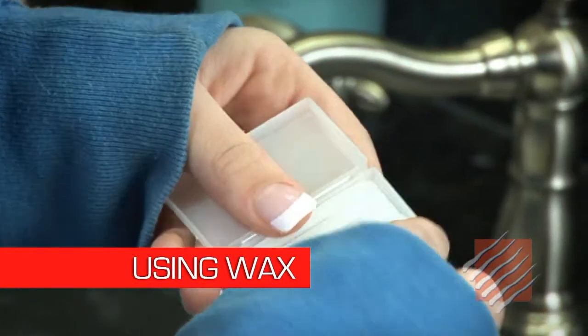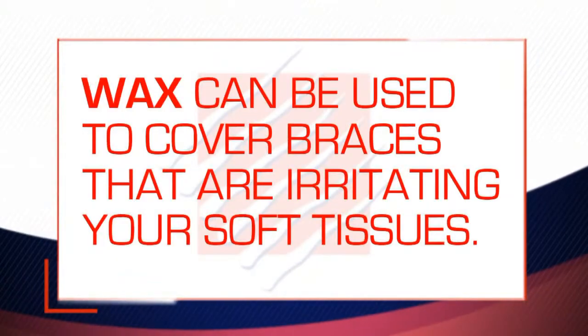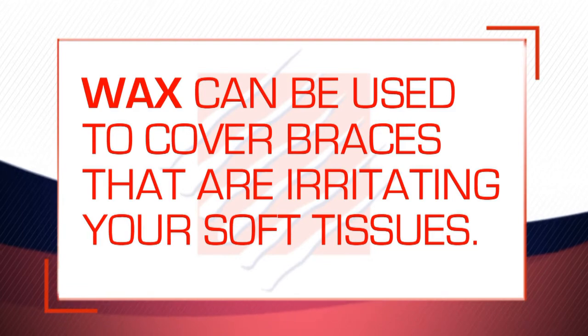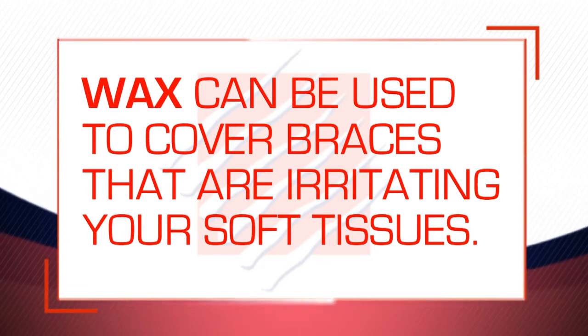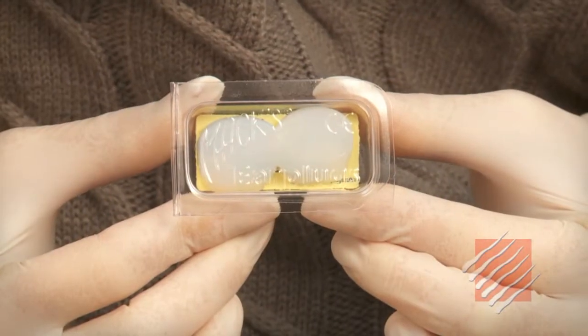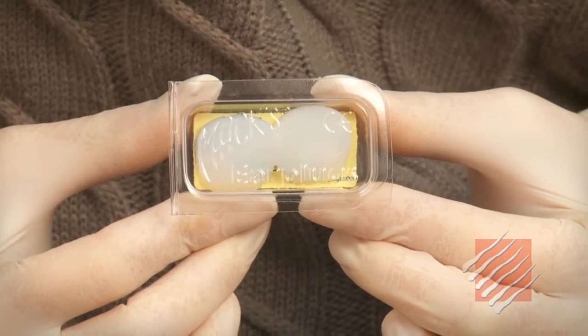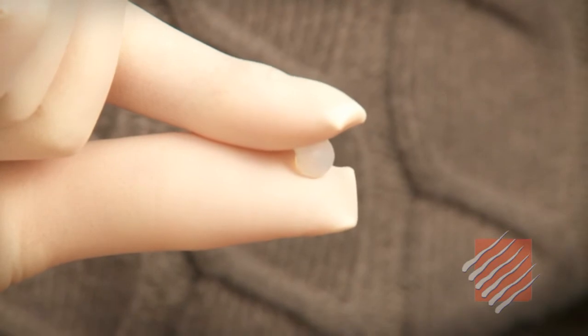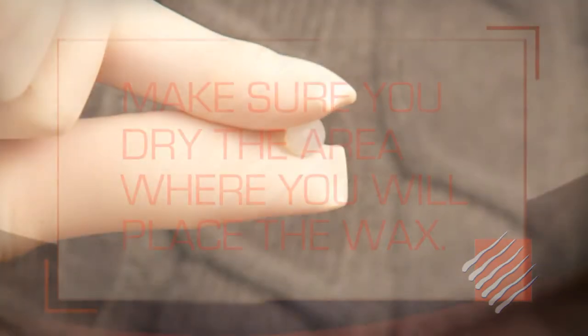Okay, now let's talk about wax. Wax can be used to cover braces that are irritating your soft tissues like your cheeks, lips, and your tongue. And here's how to do it. Pinch a small amount of wax out of the package, just large enough to cover the particular brace or wire that's causing your discomfort, and roll the wax into a little ball like this.